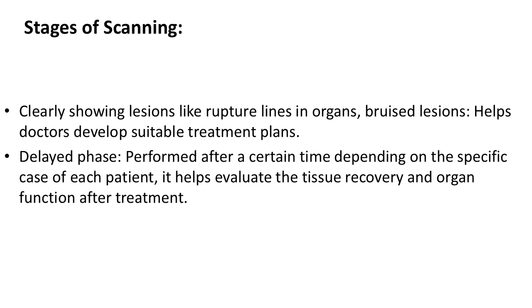Delayed phase performed after a certain time depending on the specific case of each patient. It helps evaluate the tissue recovery and organ function after treatment.